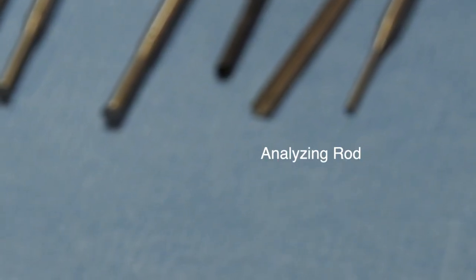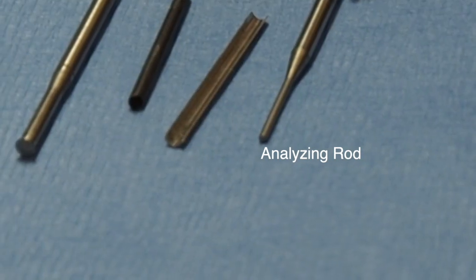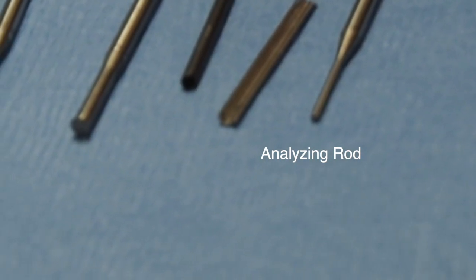Now all of this, I'm understanding, might be obsolete in that you can't file. But here you have what we call the analyzing rod. I'm trying to see, am I really focused in on that well? There we go. The analyzing rod, which is just straight.